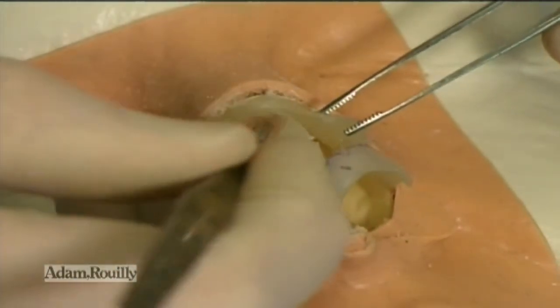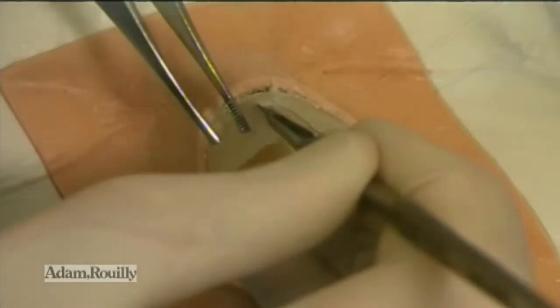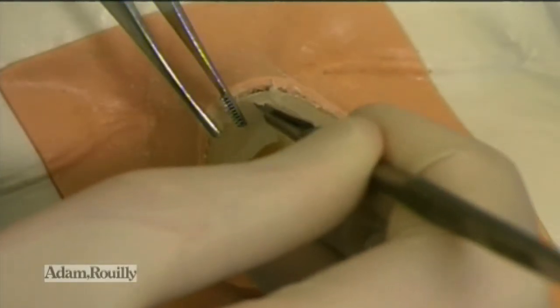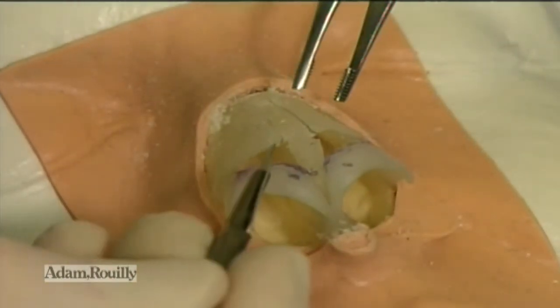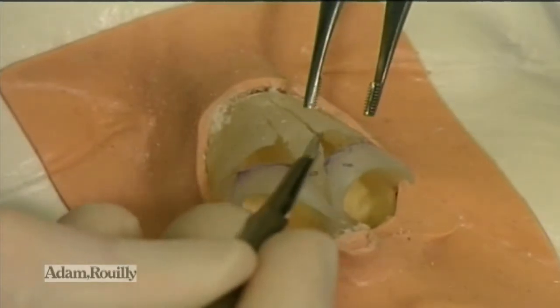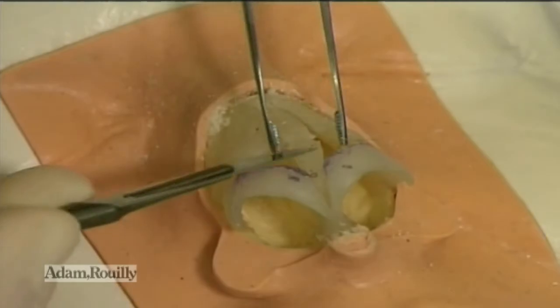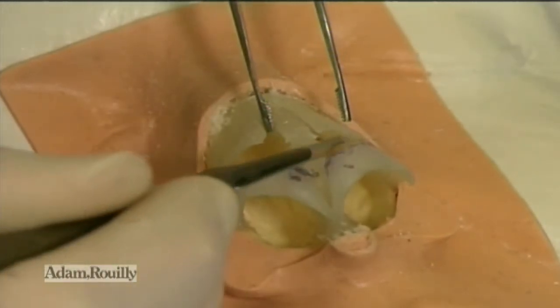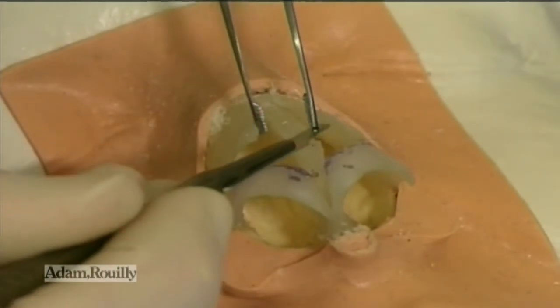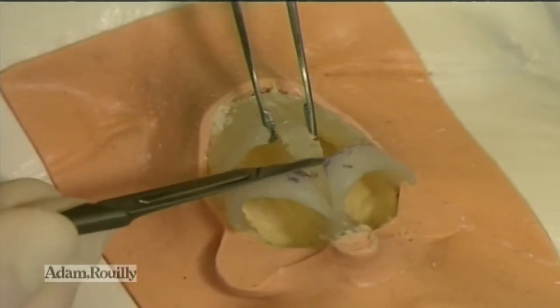Next, we divide the upper laterals from the septum by sharp dissection. This effectively leaves a cartilaginous dorsum in three sections. Initially, we want just to reduce the central portion alone, and to avoid reducing the upper laterals unless absolutely necessary, to avoid a sharp dorsum and to avoid a later inverted V deformity.